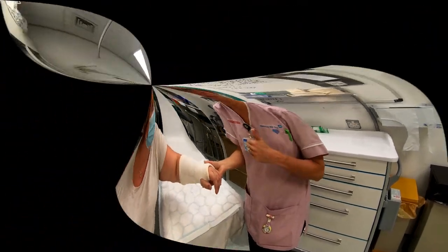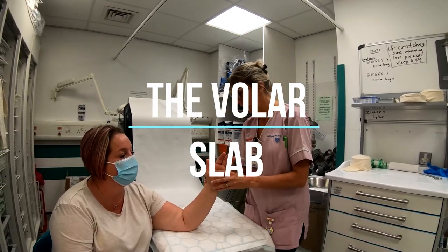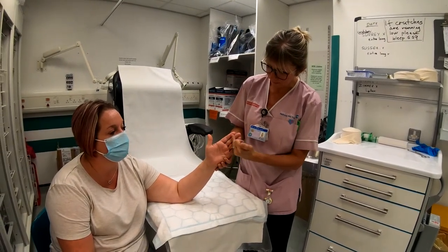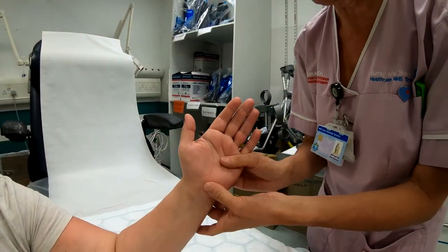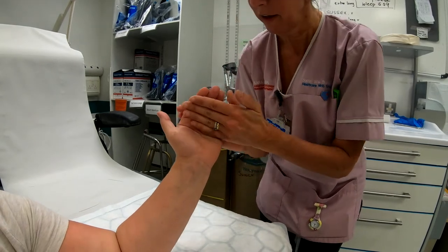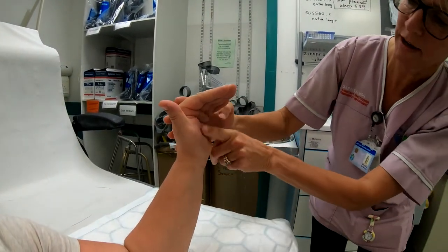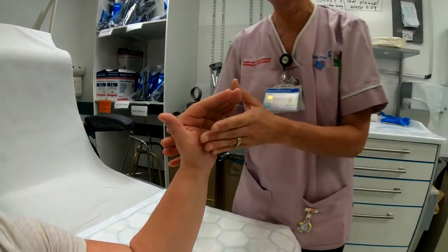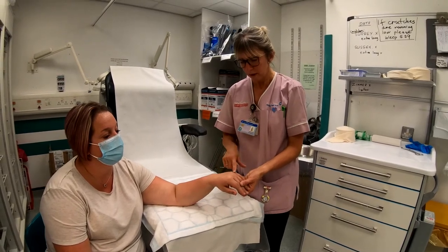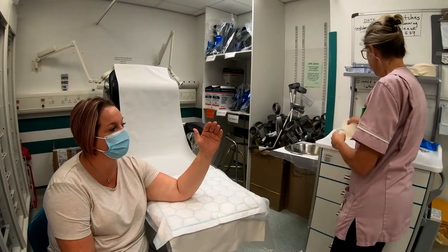Now we're going to show you a volar slab. A volar slab means it goes on the palm side of the hand and wrist. The volar slab will extend all the way to the distal phalanx of the fingers, and we're going to have full extension of the wrist with the fingers coming forward at the MCPJs — the knuckles — like a swan neck position. The slab is to protect the hand because generally a volar slab is applied when there's a fracture of the metacarpal bones — your classic punch injury.